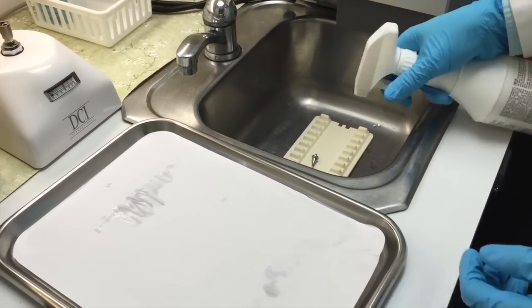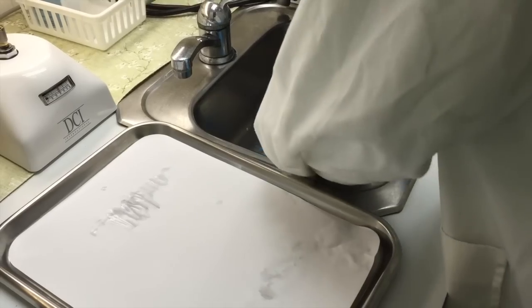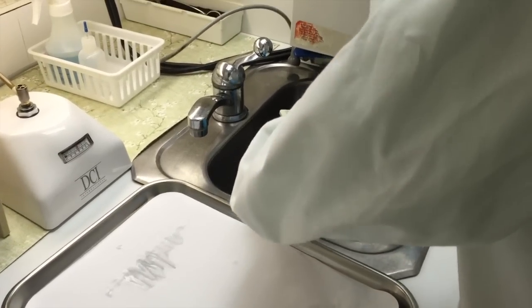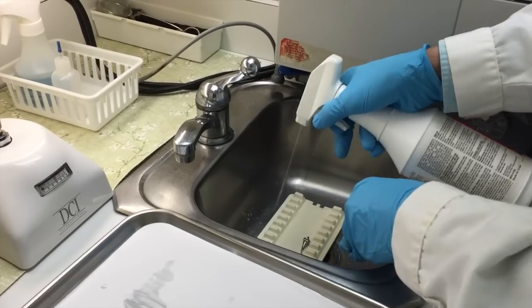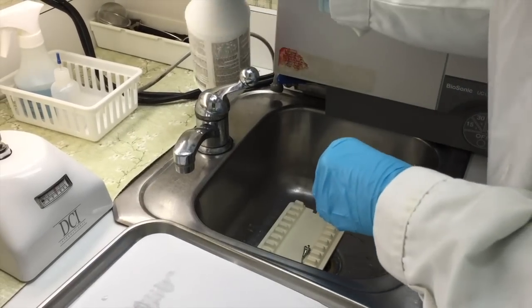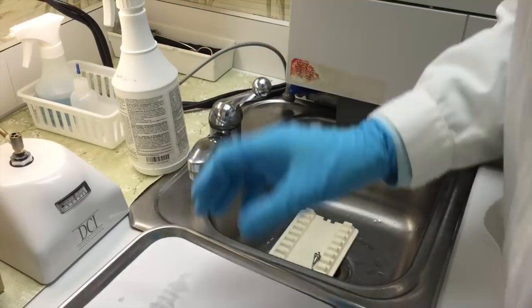We're going to take a surface disinfectant and thoroughly spray this down. Make sure you get both sides of the tray. We're going to let that sit on there for just a minute. While that's sitting there, we'll get rid of the paper.